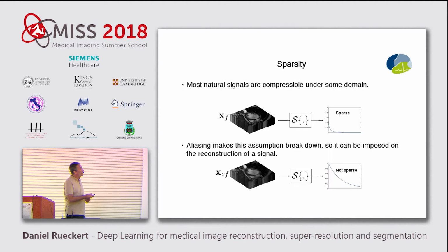And these sparsity priors are generally very, very generic. They just basically involve the L0 norm or the L1 norm. In contrast to this, the approaches down here, which we'll discuss a bit more in detail, effectively learn what is the best prior for your data, what is the optimal way of doing this. Okay? So what does sparsity have to do with all of this?